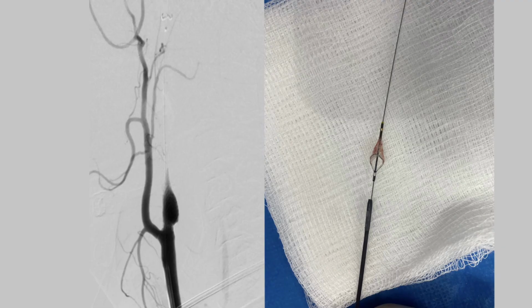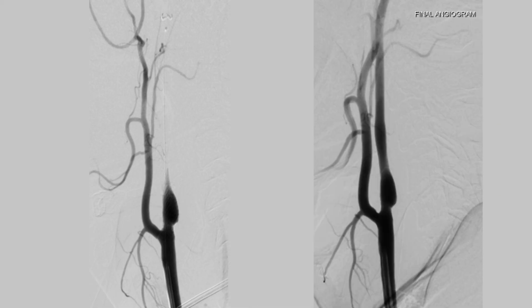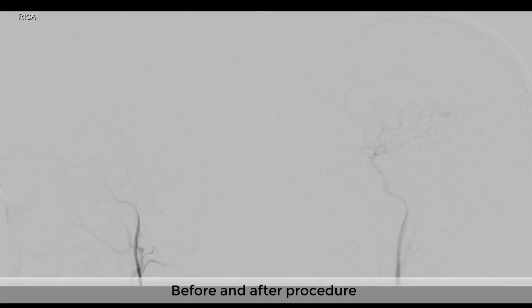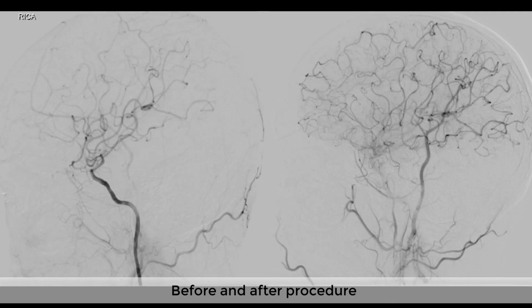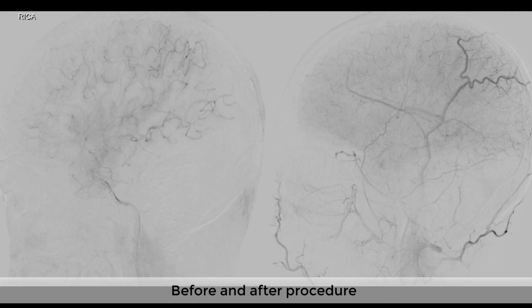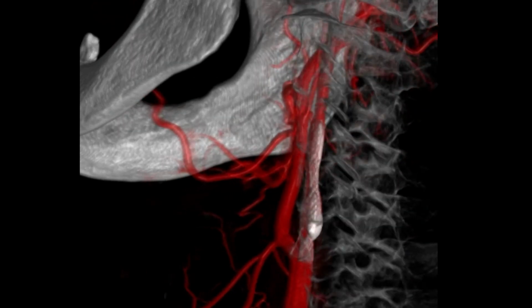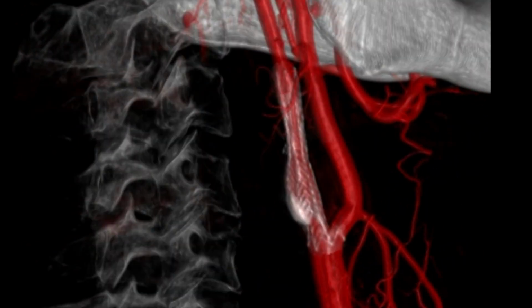So we could conclude that the sudden occlusion of the carotid artery after balloon angioplasty is most likely due to release of a lot of embolic materials which were trapped by the filter device, causing the complete flow arrest across the carotid artery. Once we removed this filter device, the flow is restored. Final angiogram showed complete revascularization of the internal carotid artery and good restoration of the intracranial circulation. This also implies the importance of use of filter device during carotid artery stenting procedure.